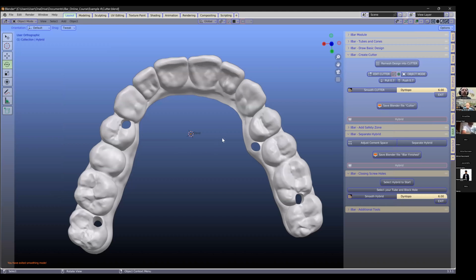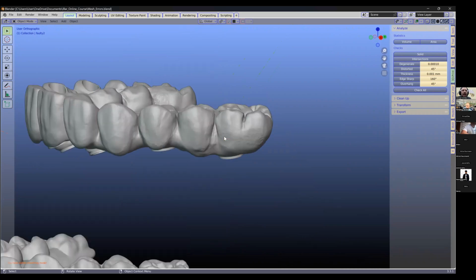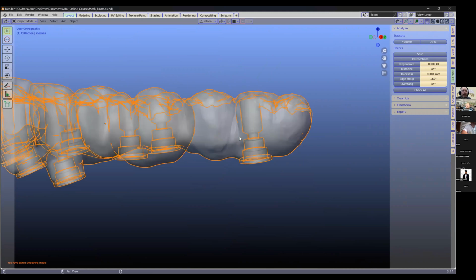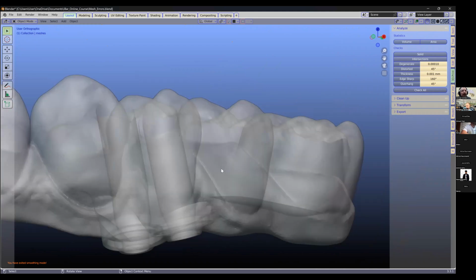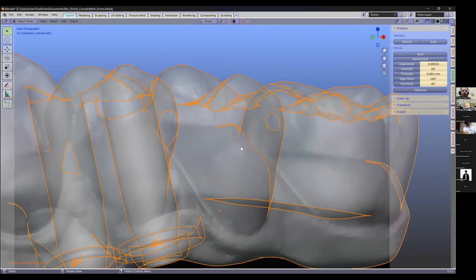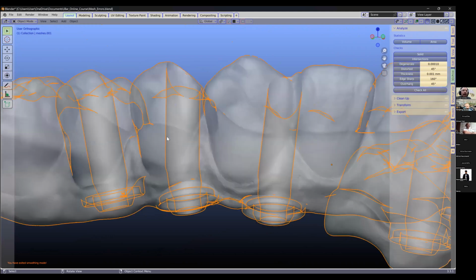Okay, when you're doing an iBar, we've already discussed a few things with the contacts. I don't really have to go back into it. Like here, for example, you can see we need more space in this one. We would smooth that. So we've gone through this quite a few times. The evaluation of enough cavity.